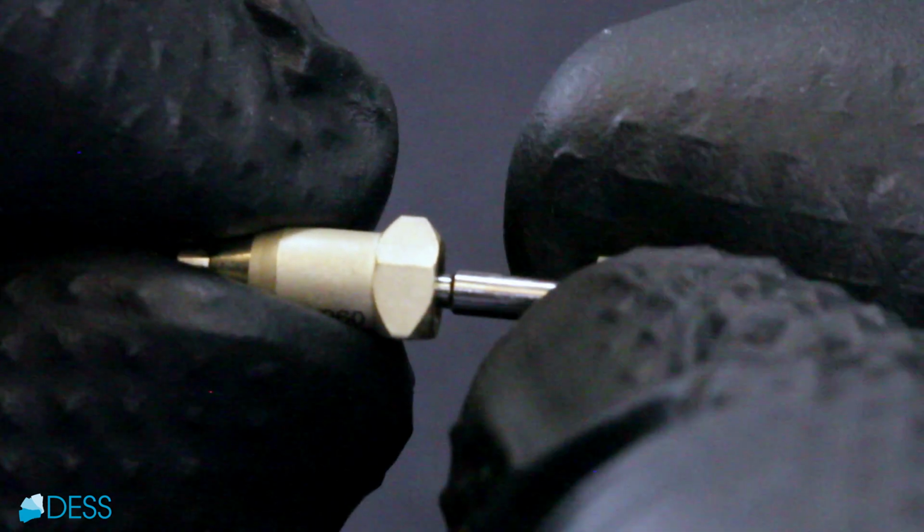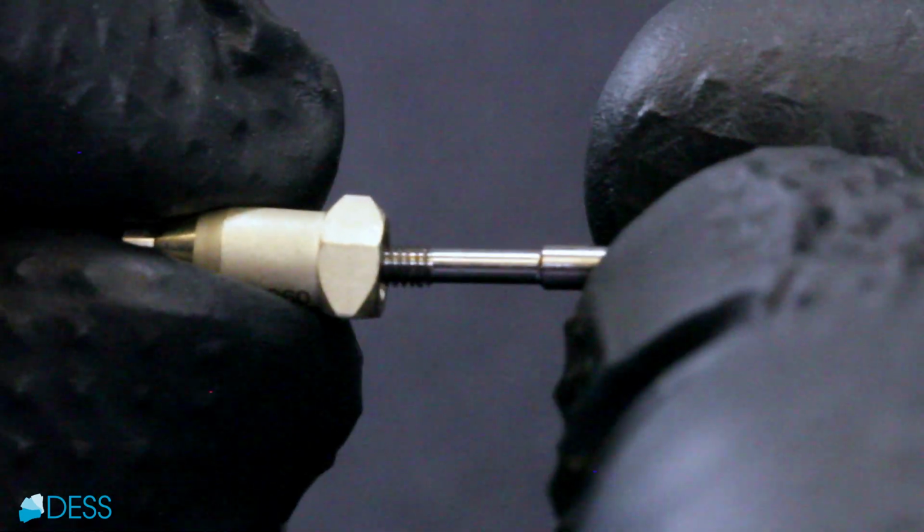The last aspect of the screw that holds the Scanpost in that I like is the fact that the screw can totally separate from the body. So if we want to throw this thing in the steamer to clean it, we can totally separate it to make sure all the bacteria and stuff out of the middle of the post is out of there. I really do like that aspect.